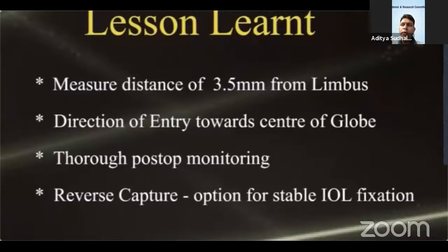So one definite contraindication would be aphakia, but also scleral fixated lenses where you see a lot of gap between, say, the iris and the lens, or the lens and the vitreous cavity. So these implants, and especially in fluid vitreous, because these eyes have inevitably undergone vitrectomy, and then that itself predisposes that eye to anterior migration of the implant.